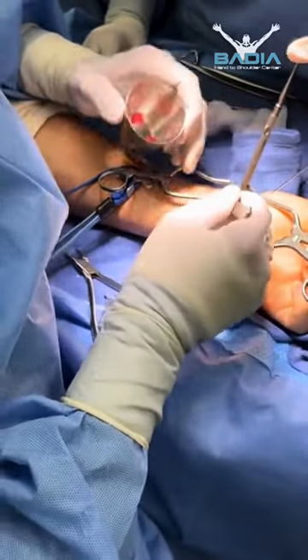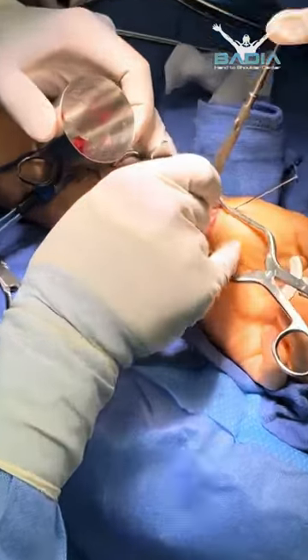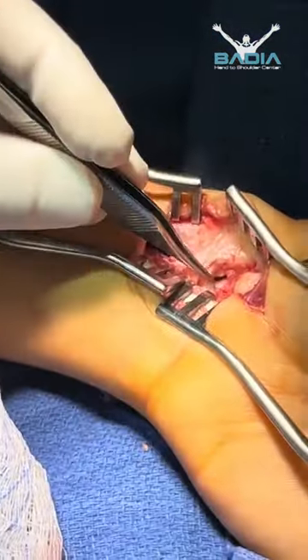It's a very good bone graft that we took from the radius, and here it is — I'm putting it into the scaphoid. You can see where that red is; that's the graft in there.